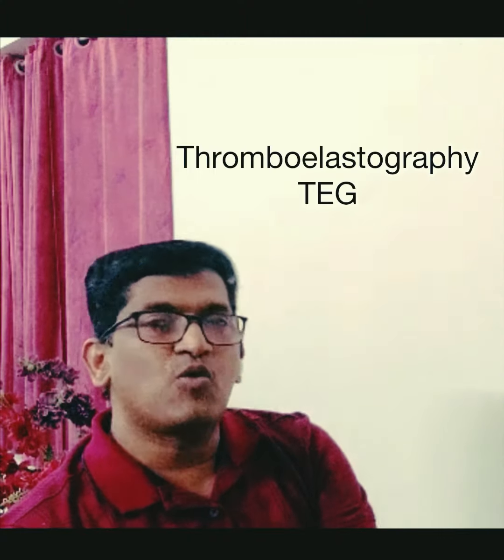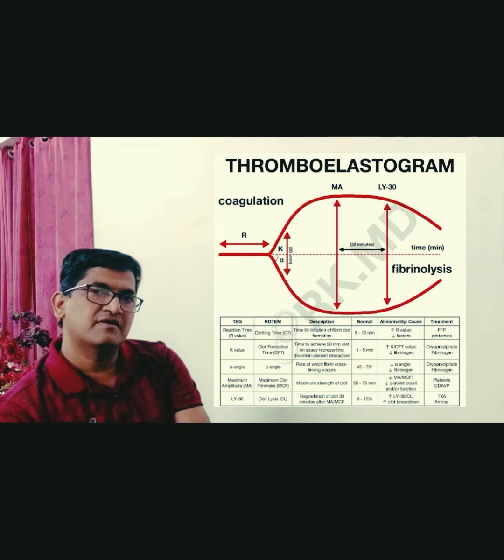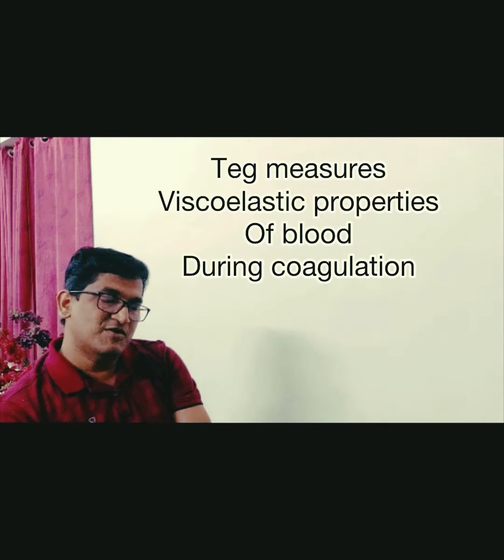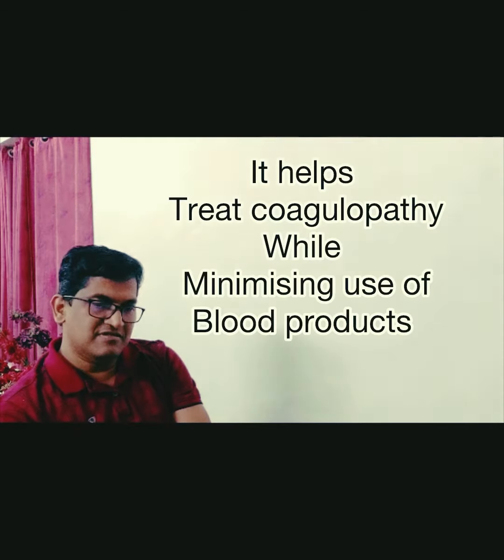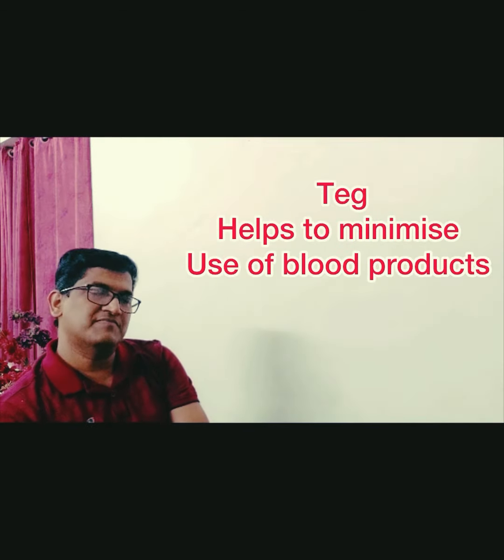Today we are going to discuss the ever increasingly popular evaluation of clotting in a critically ill patient, the thromboelastography, or commonly referred to as TEG. TEG measures the viscoelastic property of blood during coagulation. It helps treat coagulopathy while minimizing the use of blood products.